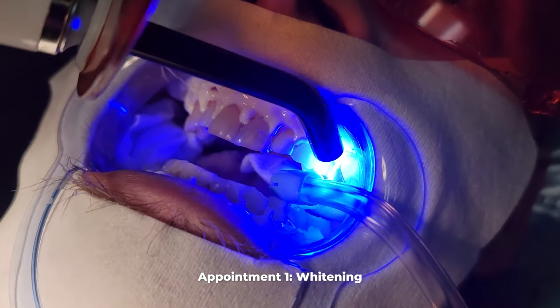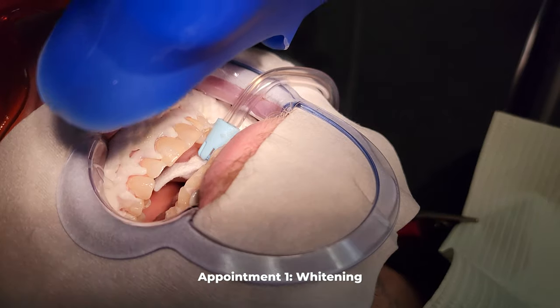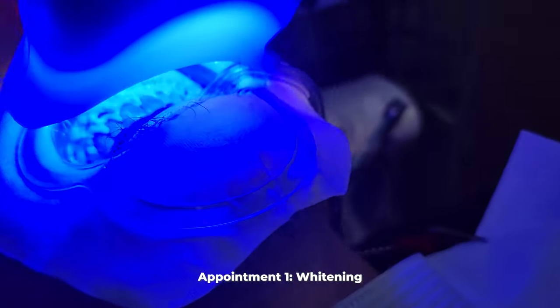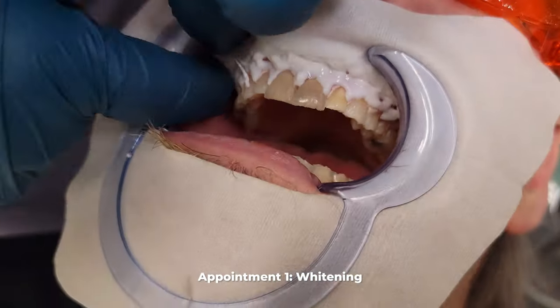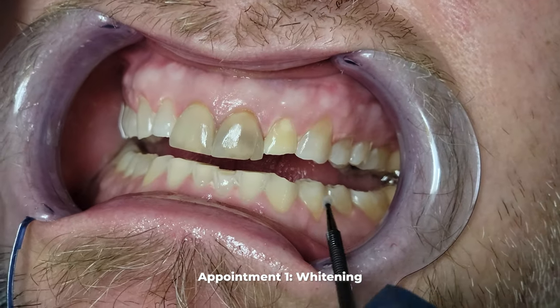You have to start the procedure by whitening the teeth because not all the teeth are going to get crowns in this case. You will need to match crowns at least a little bit to some of the natural teeth, and if you don't do that, the crowns that you make will kind of stand out.